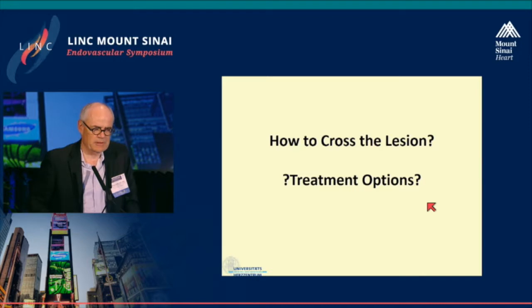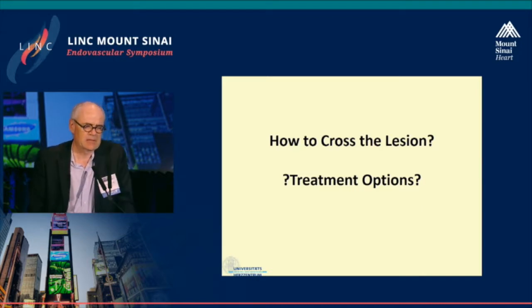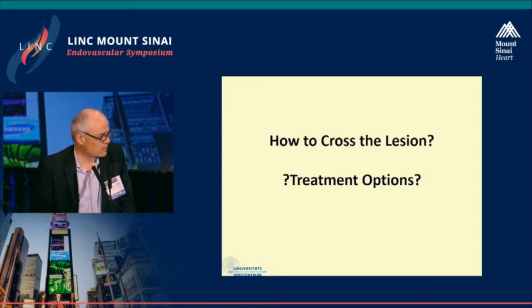So key questions that have to be asked every time you are targeting such a lesion are how to cross the lesion and which treatment options are available. So first of all, who believes that it is possible to cross such a lesion in the true lumen?